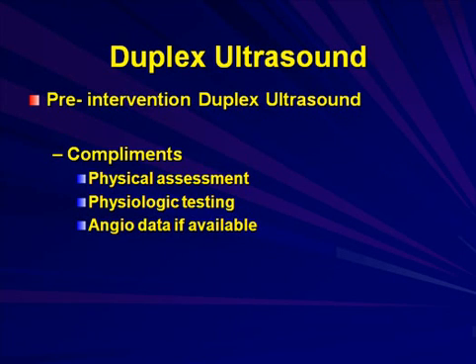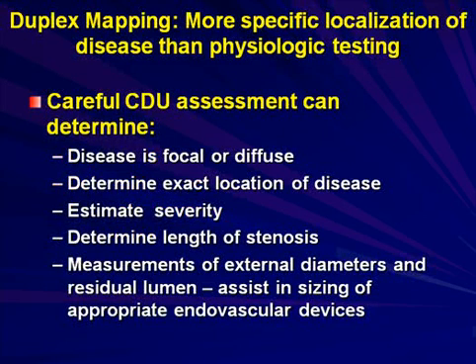We're going to talk pre-intervention, post-intervention, and then we're going to talk about aortic endografts. The pre-intervention duplex complements the physical assessment done by the physician on the patient, as well as any physiologic testing or angiograms done prior to the duplex ultrasound.